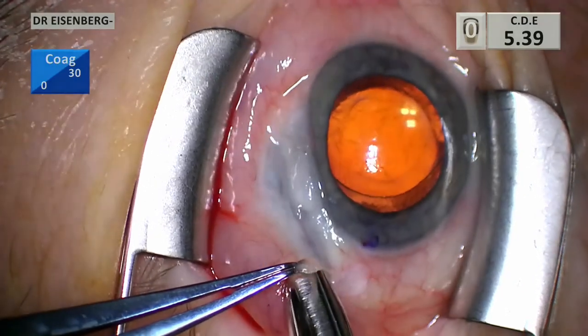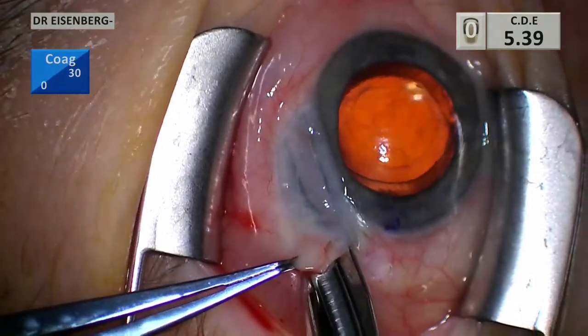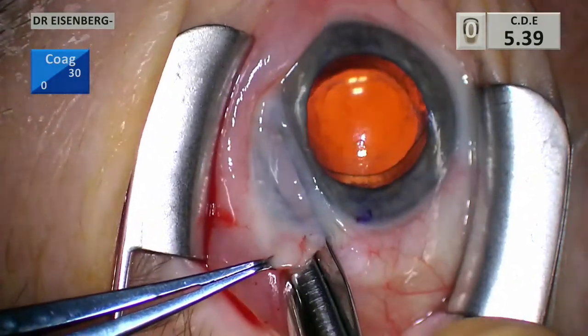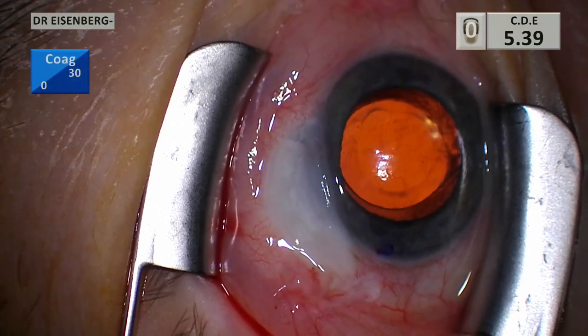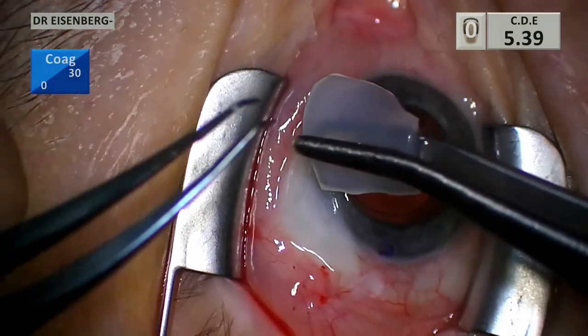Then I change to a scissors that has a longer nose and is a little more blunt, so it allows me to do blunt and cutting dissection at the same time. The goal is to get to the other side of the bleb, because we're going to be passing a needle all the way through.